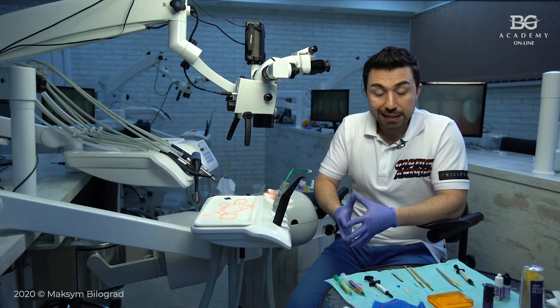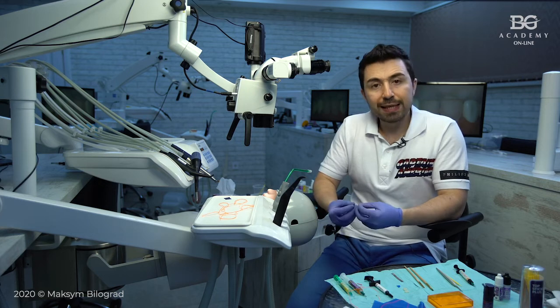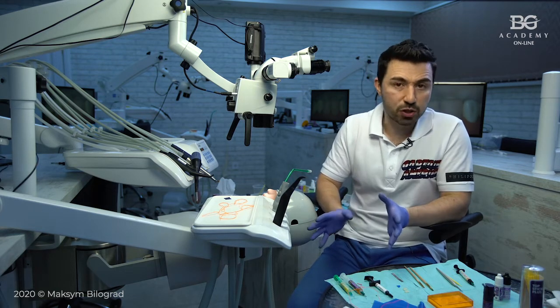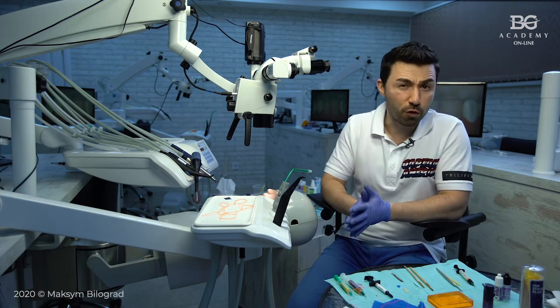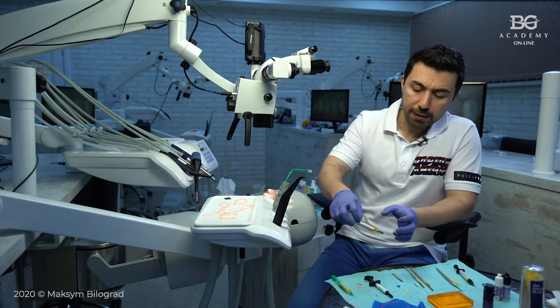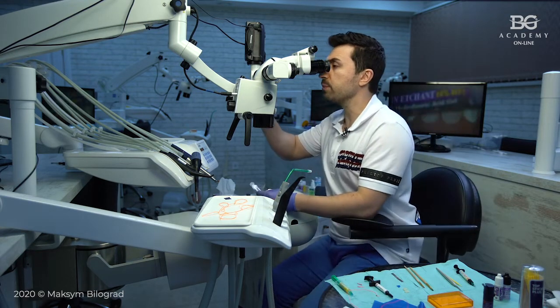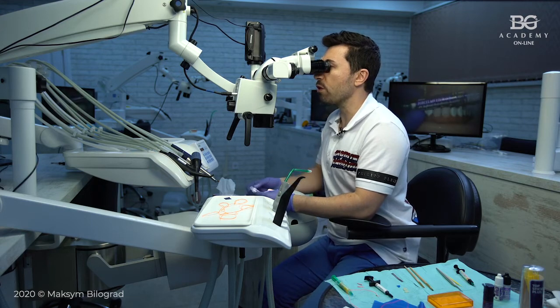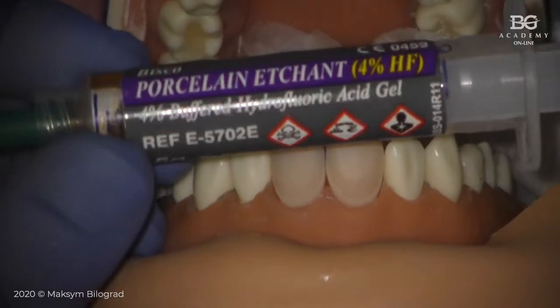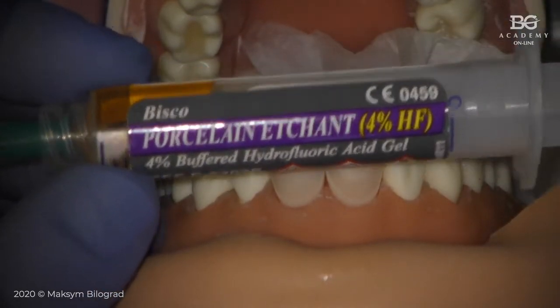Basically, if you have lithium disilicate ceramics to be bonded, we may use a low percent of hydrofluoric acid. Let's say 5%, or it can be 4, 4.6, 4.7. So this is a low percent ceramic etching gel. Let me show you here. The one that I'm using is from Bisco. It's a porcelain etchant, 4%. So this is what we will use for Emax, or for lithium disilicate.